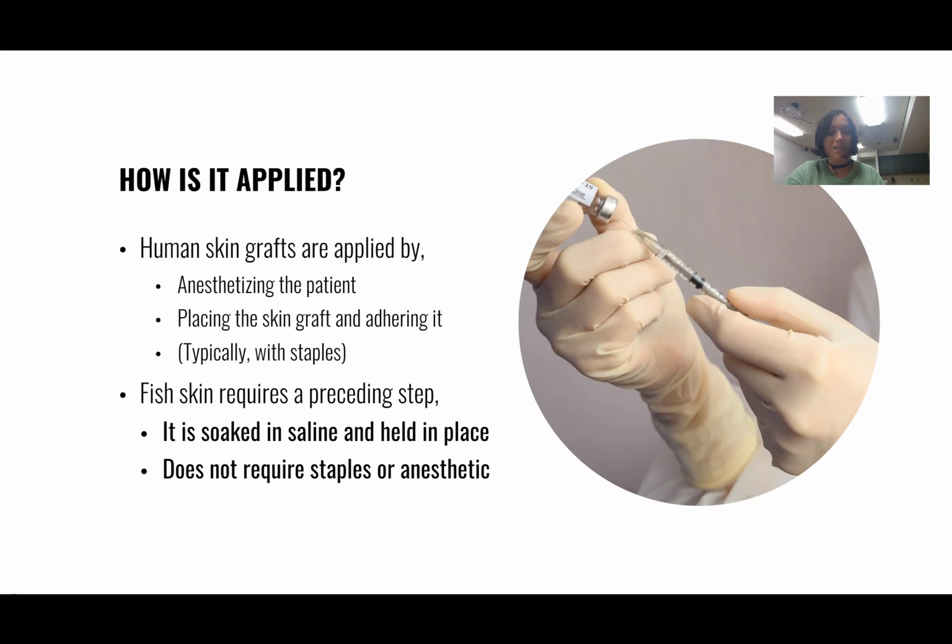So fish skin, as an alternative, does require a preceding step, which is to soak it in saline, but it is then held in place and simply wrapped around with gauze, and it does not require staples or anesthetics.